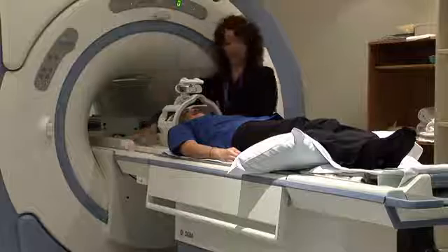Movement is the real enemy of MRI because of the way that the k-space data is acquired. In a CT, if you move, you might ruin one image, but with the way the data is acquired on MR, if you move, then that may translate through a whole packet of images.